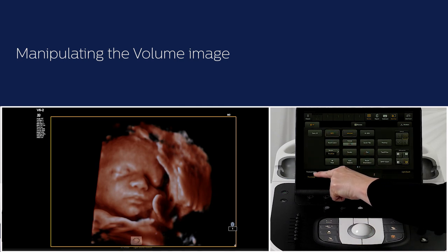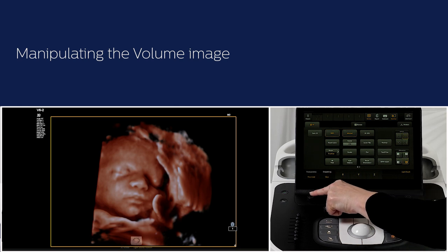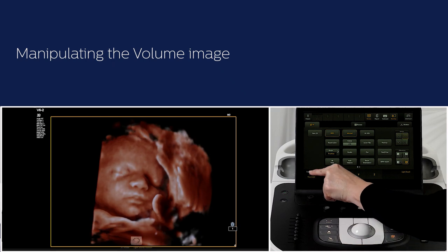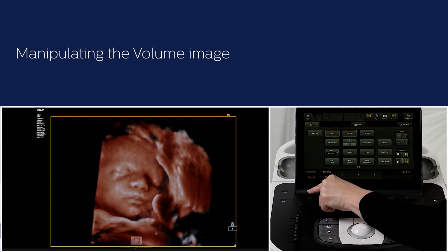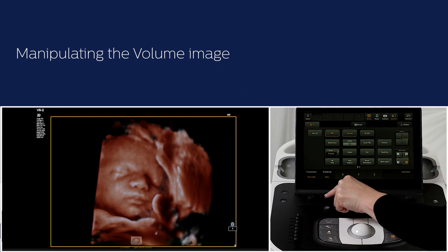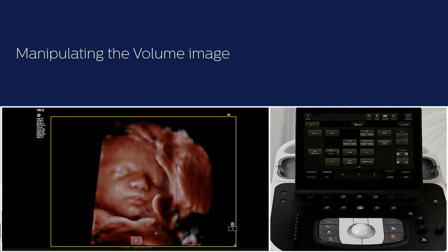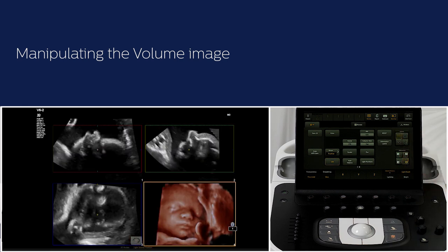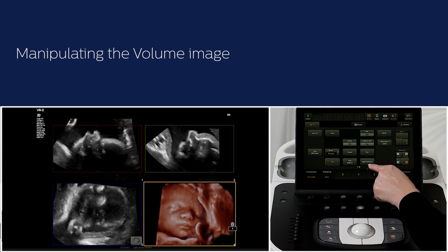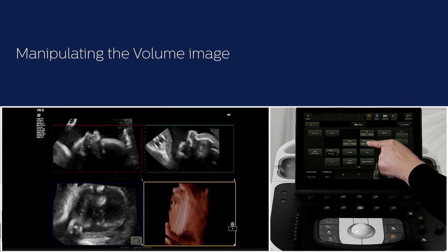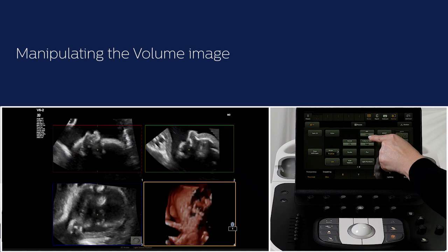The threshold, transparency and smoothing can be used to optimize the volume image. Select these on the touch screen or press on the rotary knob to select and turn the knob to adjust. On the second page of the touch screen, volume chroma, lighting and bright is available if further optimization is needed. Let's go back to a 4-up layout. The dotted line or volume view can be changed depending on which direction you want to view the data set. On the second page of the touch screen, press volume view. Notice how the dotted line changes position in the ROI boxes.